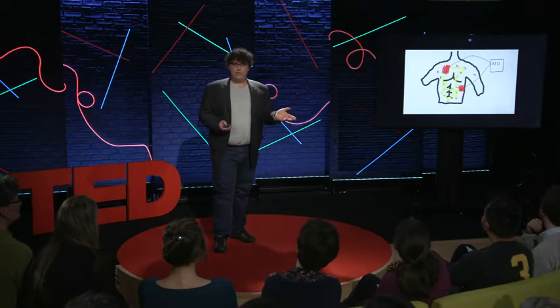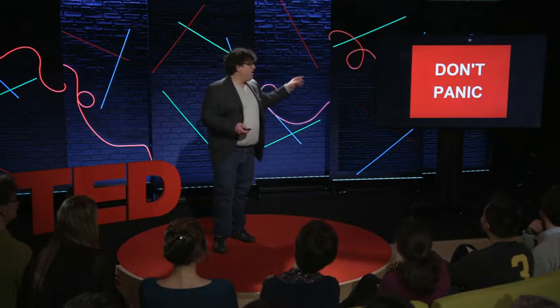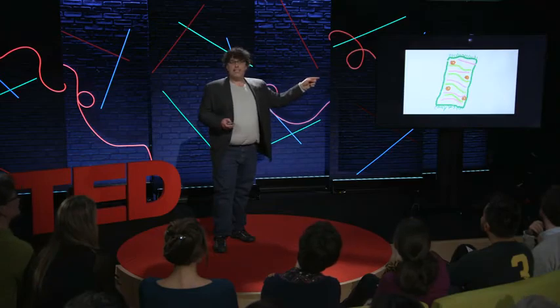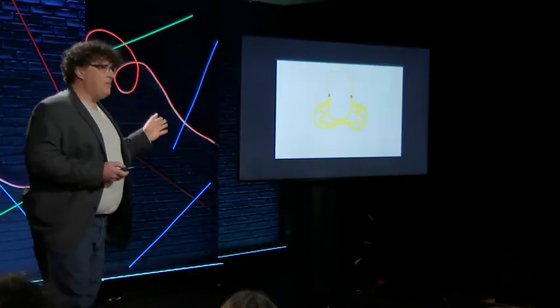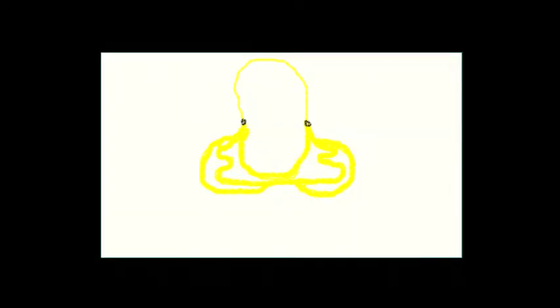We can correct this with the immortal words of Douglas Adams, don't panic, which most of us have done today, and also always having a towel. So good words to go by. The metal bikini, unfortunately, this is where panic sets in. Like the modern bra, we have to make sure we remove it, because this can cause severe arcing along with burns.